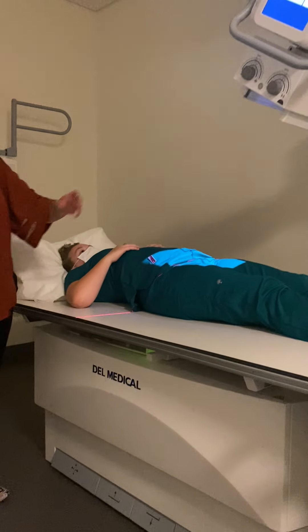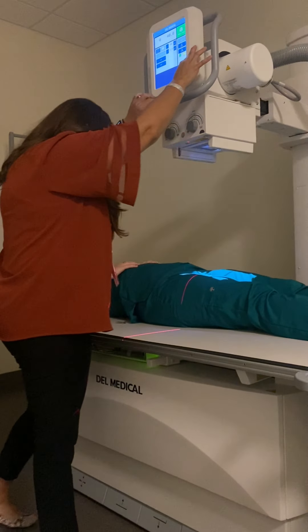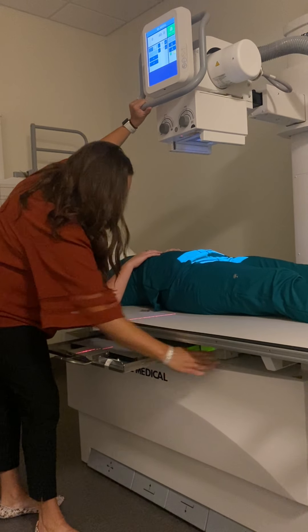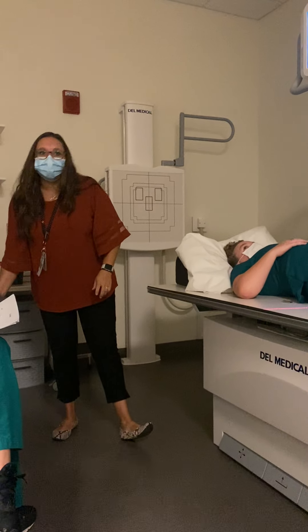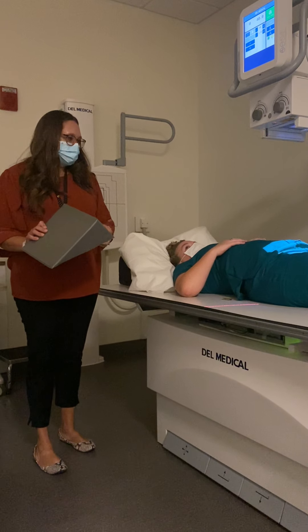For the obliques, I'm going to take my angle off and realign my tube and bucky. To get my patient oblique, it's a more shallow oblique than we usually use — it's only a 20 to 30 degree oblique. I'm going to use a smaller sponge.